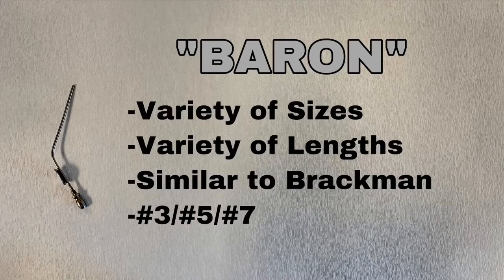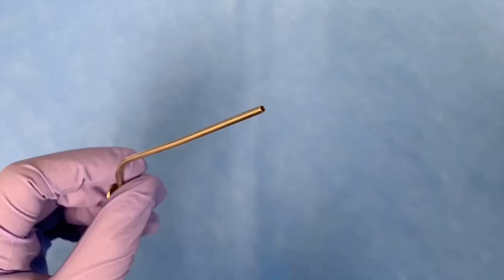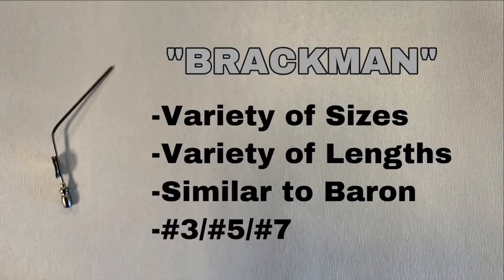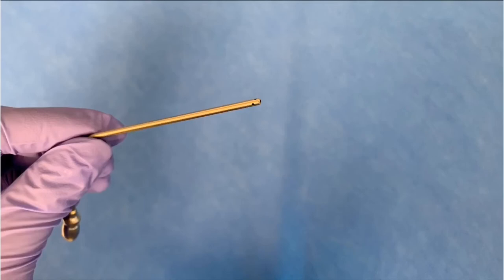This is the Baron suction. It comes in a variety of sizes and lengths, similar to the Brackmann suction. Common sizes are number three, number five, and number seven. This is the Brackmann suction; you can easily identify it by its unique characteristic of having holes on the side by the tip.